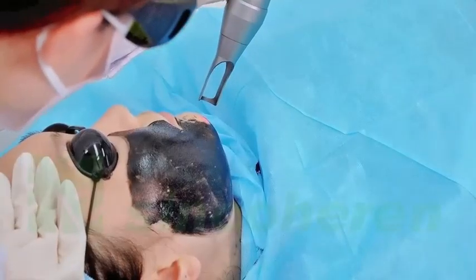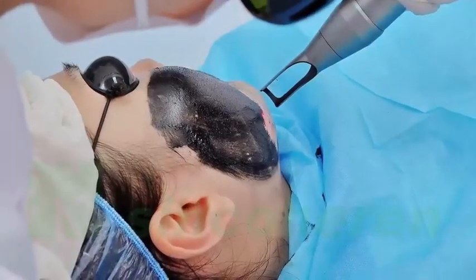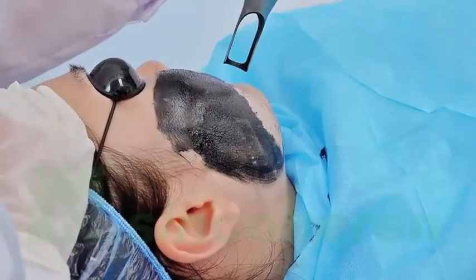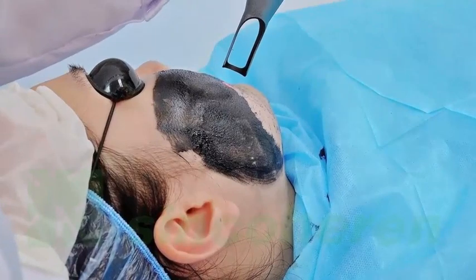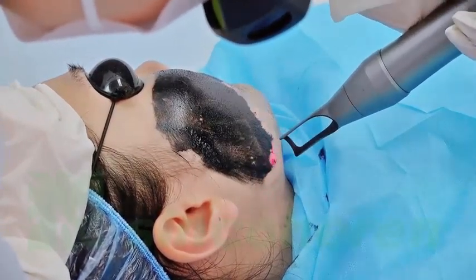Now the doctor is doing energy testing. The handpiece is vertical to the target area. There is a small overlap between the light spots to avoid missing. Always keep the handpiece from the skin within about 3 to 5 centimeters. The patient will feel a slight needle prick on the face.